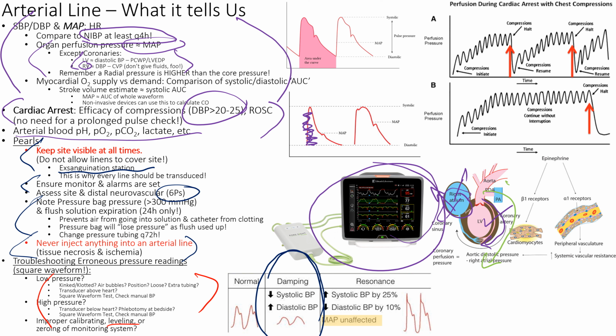Make our numbers lower. It's going to be harder for the system to bounce on the trampoline. If the patient is right here and my transducer is up here, the signal has to go all the way up and bounce on it, compared to if it was level with the patient. It depends what perspective we're looking at here. But anyways, up here is just your cerebral perfusion pressure.